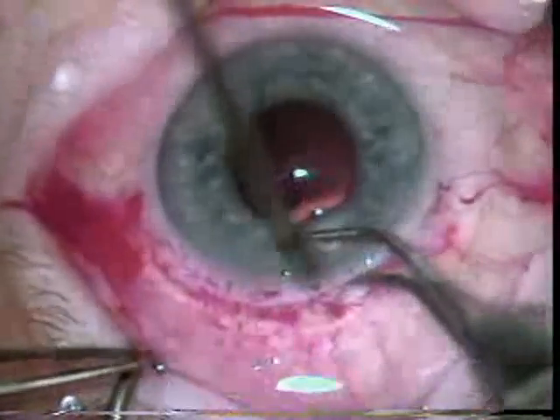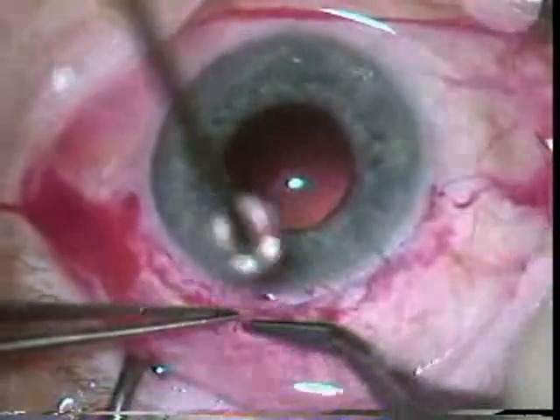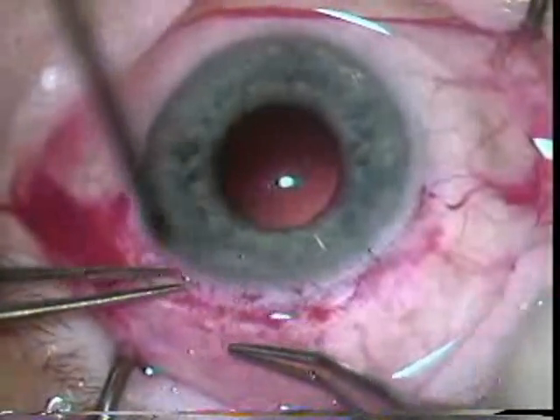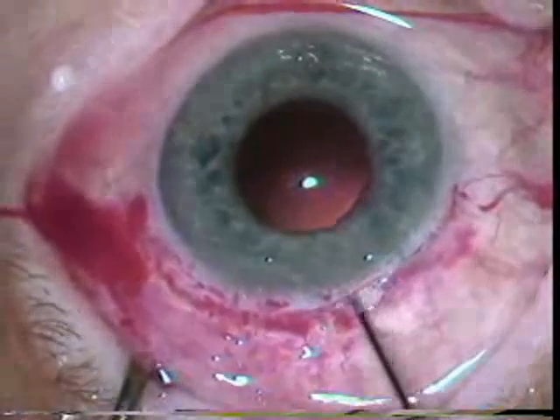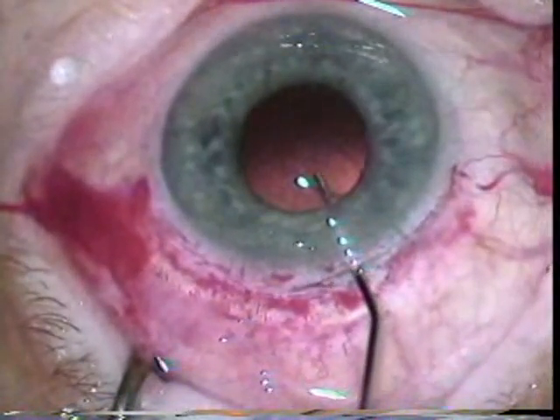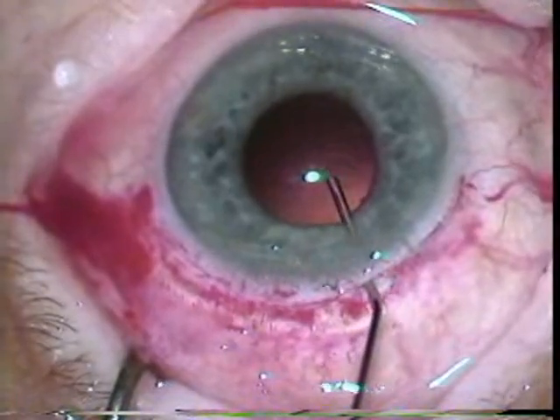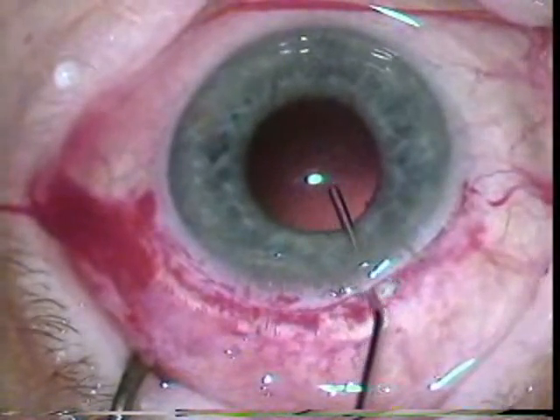Now we're just making sure that the sutures are out of the way and that there's no material in the wound. Some viscoelastic is placed — probably a cohesive viscoelastic like Healon placed in the capsular bag.